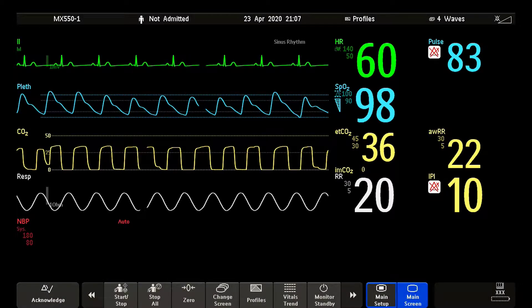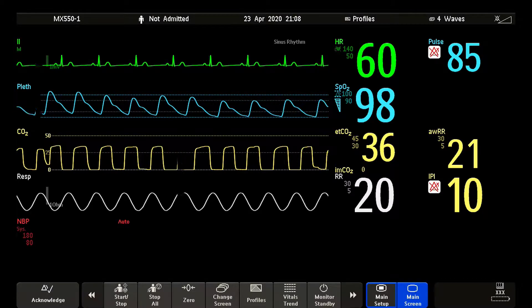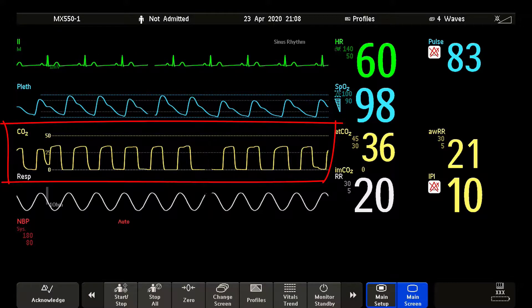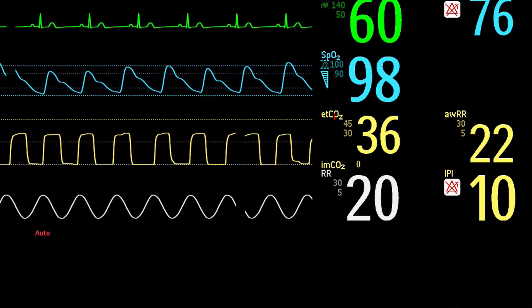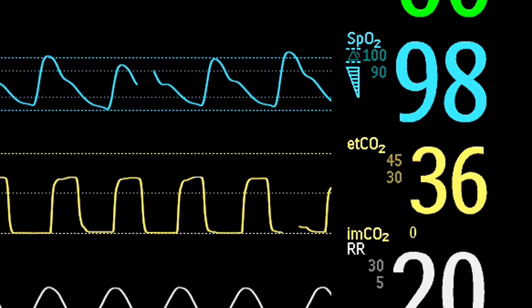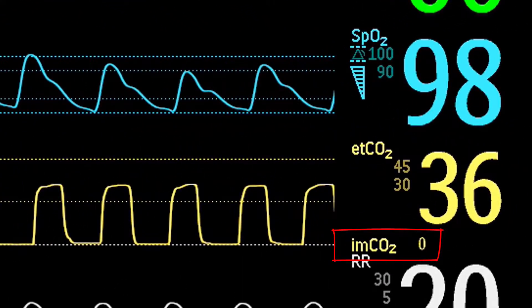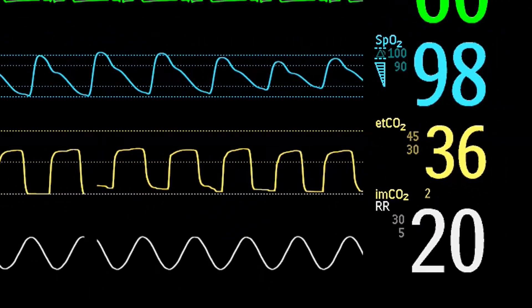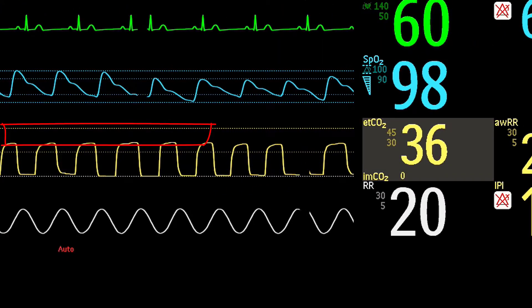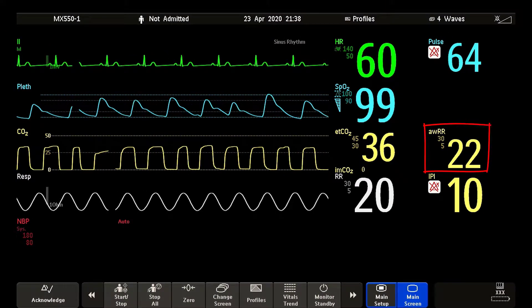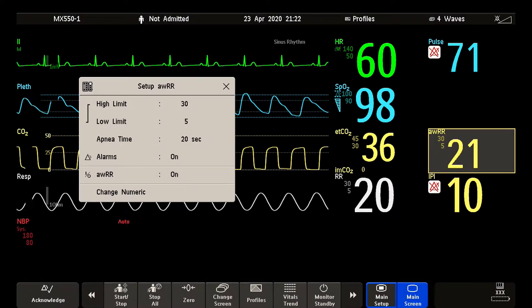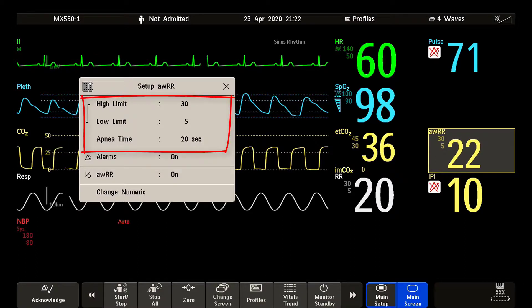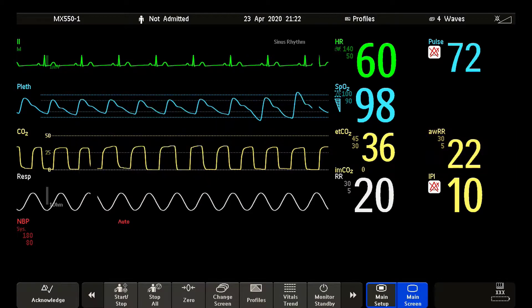Now let's look at how the CO2 measurement is presented on the Intelliview patient monitor. Here you see the waveform. This is the end tidal CO2 numeric. You may also see the high and low alarm limits displayed. This little numeric is the IMCO2 — it displays the smallest CO2 value measured during inspiration, and you can set a high alarm limit for this parameter. Here you see the airway respiration rate, calculated from the CO2 waveform. For AWRR, you can also set a high and low alarm limit and an apnea-time delay.